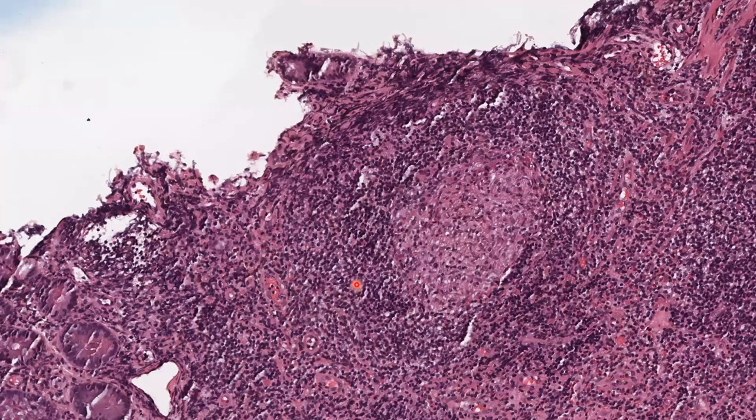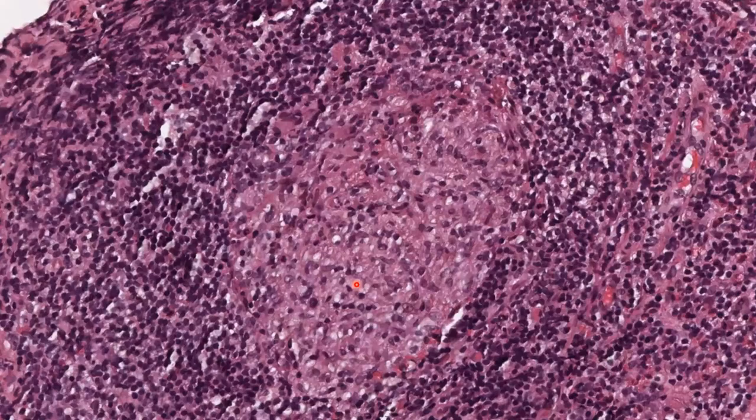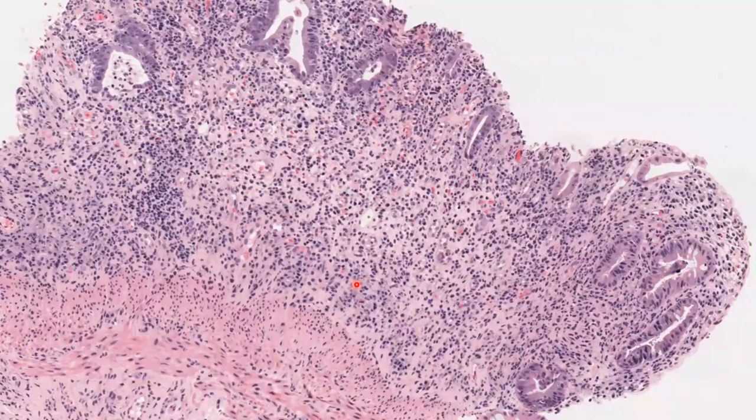In another biopsy here, you can see a very well-formed granuloma in the middle of this field. Are you going to diagnose Crohn's disease? You will never get a better granuloma than this. Did someone miss that diagnosis? No. Here are the epithelioid histiocytes to prove the theory. But no, because I told you it is not specific for Crohn's disease.